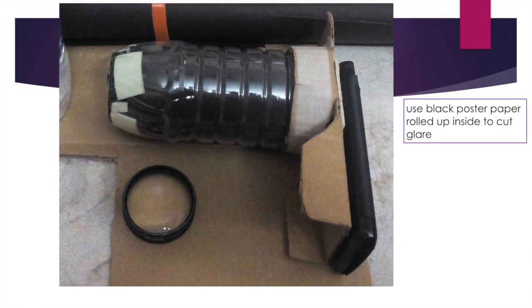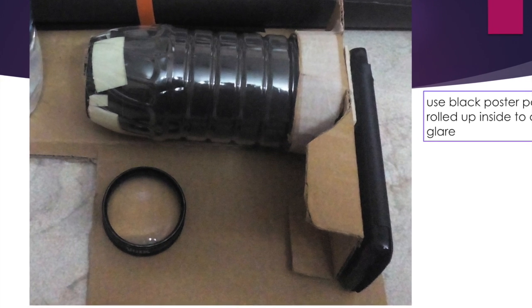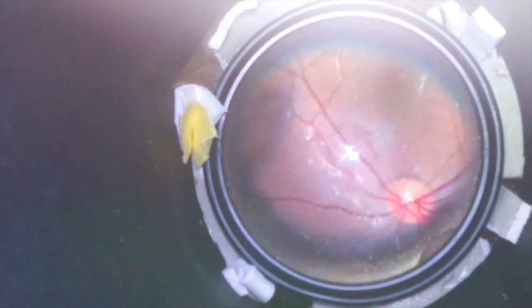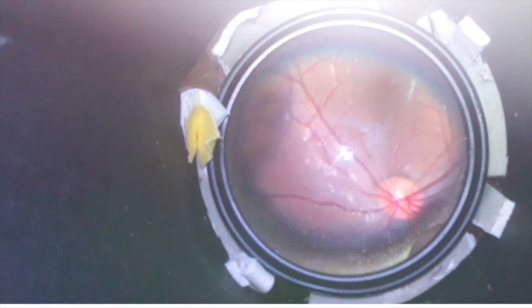Use a black poster paper and roll that inside the water bottle to control glare. Hold the entire thing, turn on the camera — the video light should be on an always-on position — and this is a kind of good fundus picture that you can easily capture.